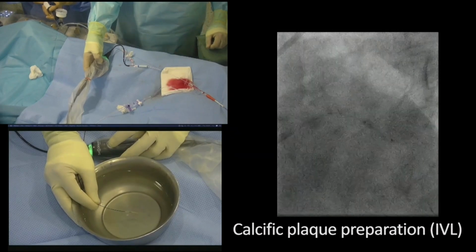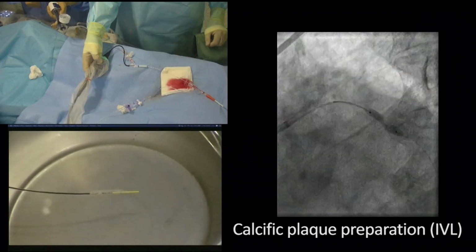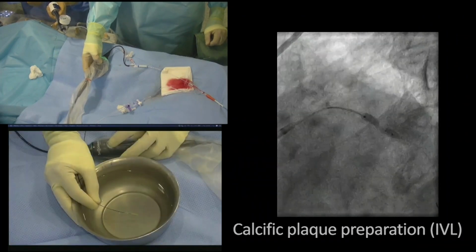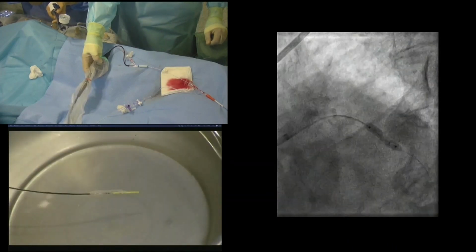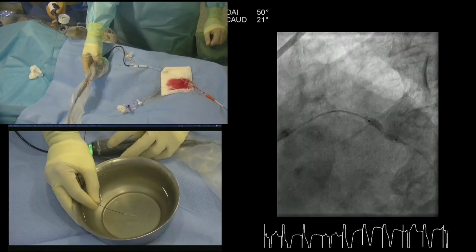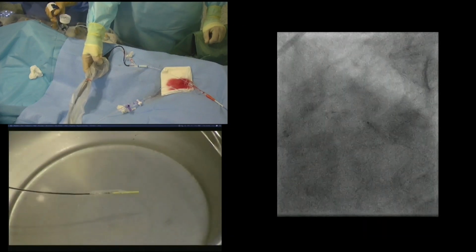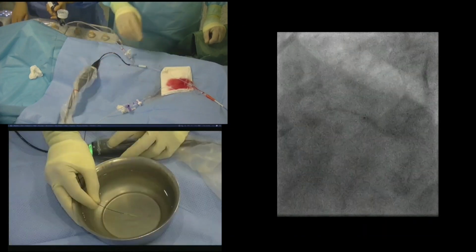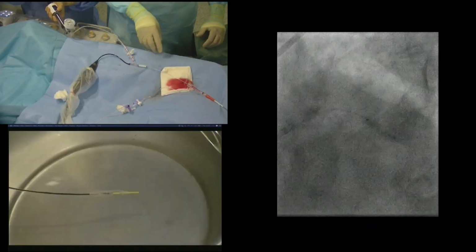We are showing you basically the way that lithotripsy works. You are seeing some images at the same time that we are performing the actual case. You may see actually the generation of the bubbles, the same bubbles that you see on the top here. Okay. And we deflate now. Yeah.